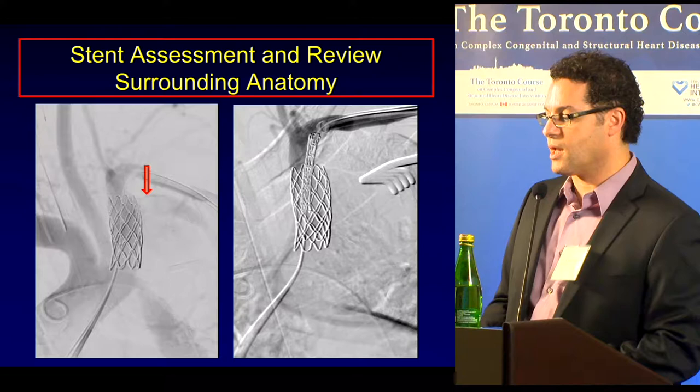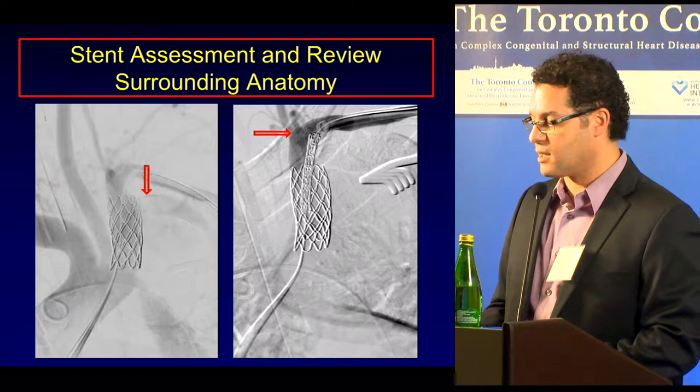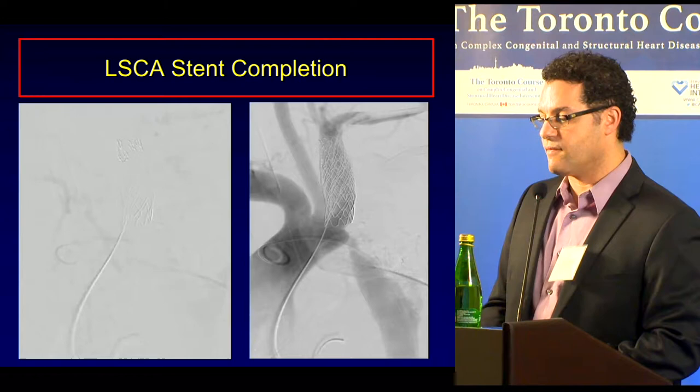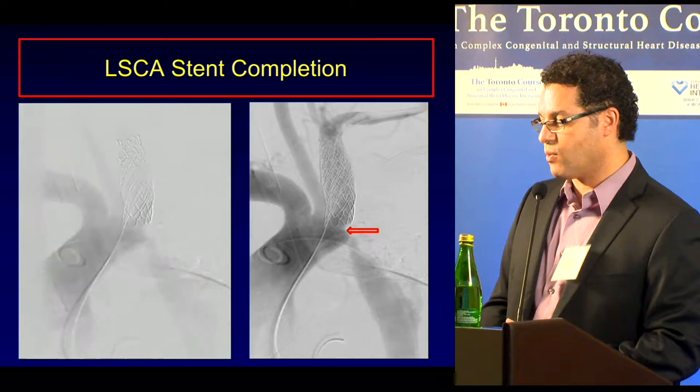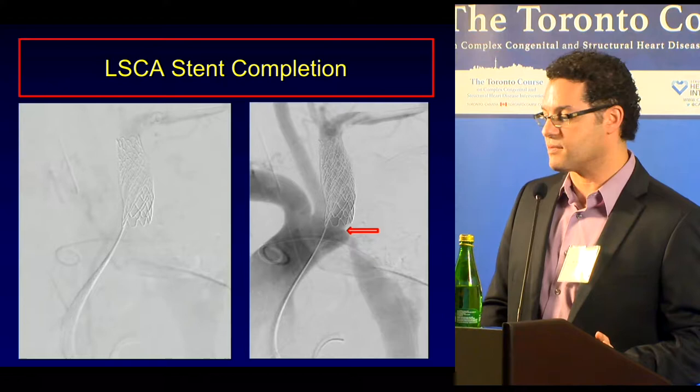left vertebral artery, put in a second covered stent, telescoped within the first, had the same problem with the sheath kinking. This one, however, stayed where it was. And then this was our final angiogram of the left subclavian artery. And that's now open. You can see, though, where you are. You've not jailed into the aorta. You've sealed the subclavian completely, and you've now recreated the wall of the subclavian for this case. And you still have the coarct now to deal with and the interposition graft.